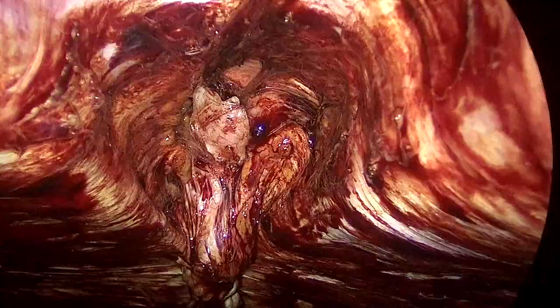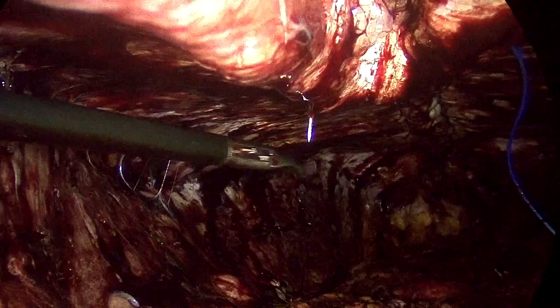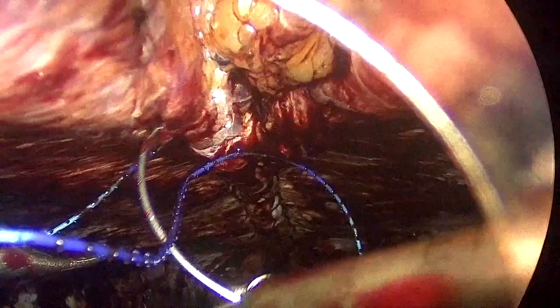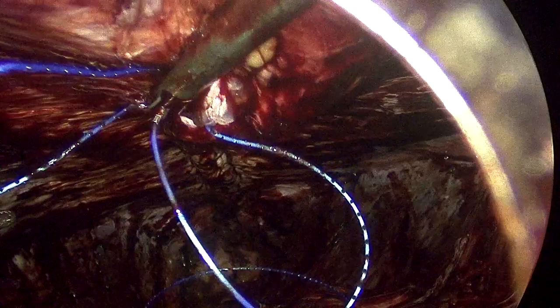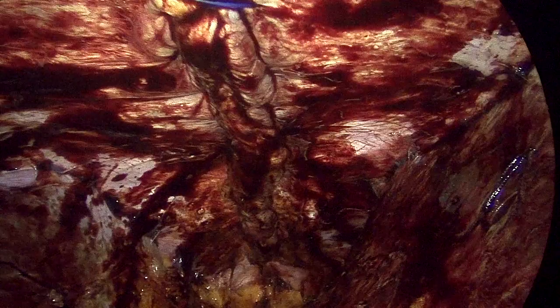I kept doing this. Fortunately, on this patient I was able to do this plication almost five to six centimeters underneath the umbilicus, which provided a very nice cosmetic result. You can see the plication — what would have been the ridge bulging in the subcutaneous space is now imbricated into the extraperitoneal cavity, and I am very satisfied with how things look.